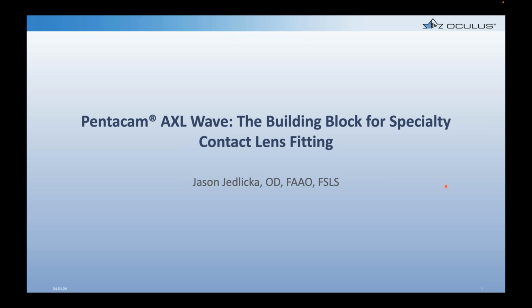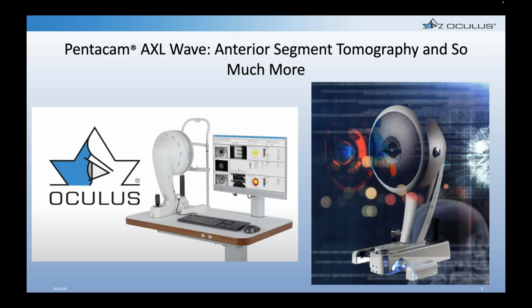Thank you, Bill, and thank you everyone for taking time out of your evening to spend this hour with me and the Oculus team. It's a pleasure as always to get to talk about how we utilize some of these great instruments. So tonight the topic, of course, is the AXL Wave. We all know the Pentacam is an anterior segment tomographer, and that's what it's really known for. But the AXL Wave is so much more. It's really a 5-in-1 tool, and we'll talk through how each of those 5 applications or functions of the device are useful to the specialty contact lens practitioner.